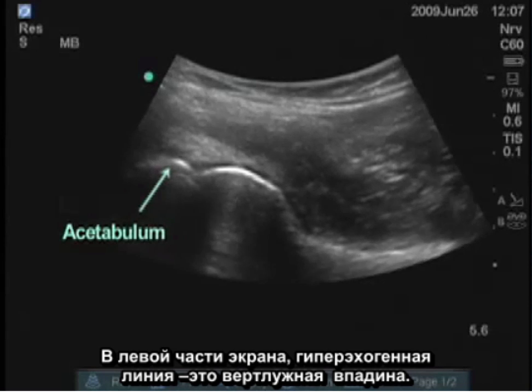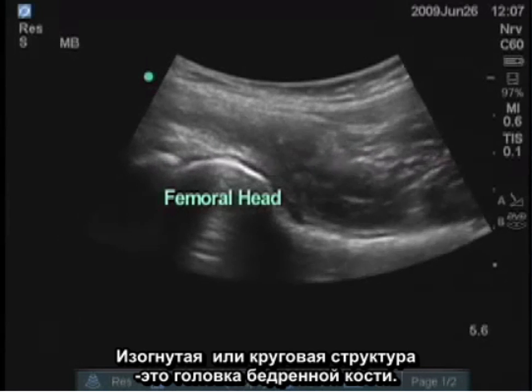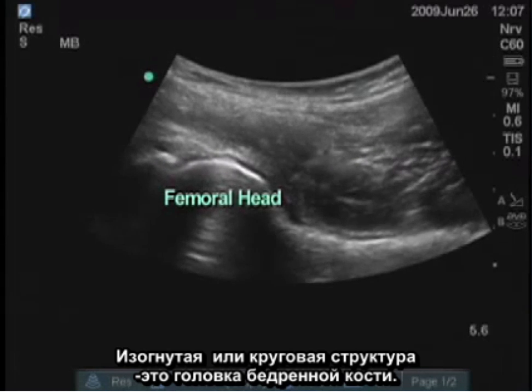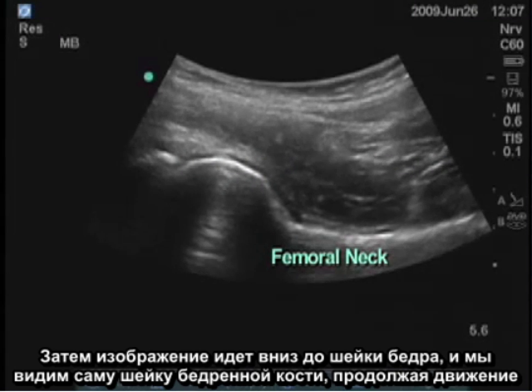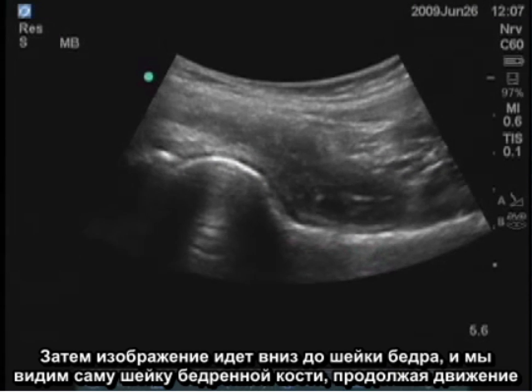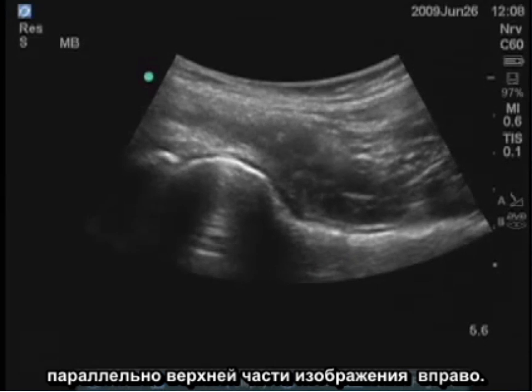hyperechoic line, is the acetabulum. The curved or circular structure is the femoral head. It then drops down to the femoral neck, and we can see the femur itself extending parallel to the top part of the image out toward the right.